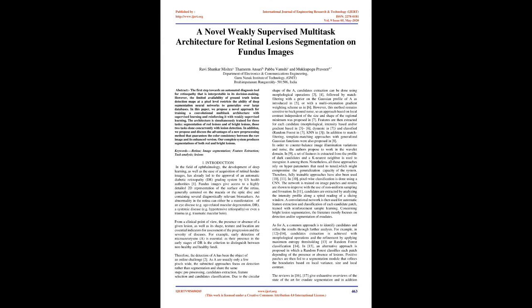For example, early detection of microaneurysms is essential, as their presence in the early stages of DR is the criterion to distinguish between non-healthy and healthy fundi. Therefore, the detection of MAs has been the object of an online challenge too. As MAs are usually only a few pixels wide, the submitted approaches focus on detection rather than segmentation and share the same steps: pre-processing, candidates extraction, feature selection and candidates classification.